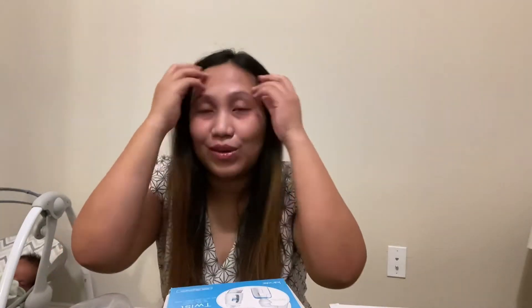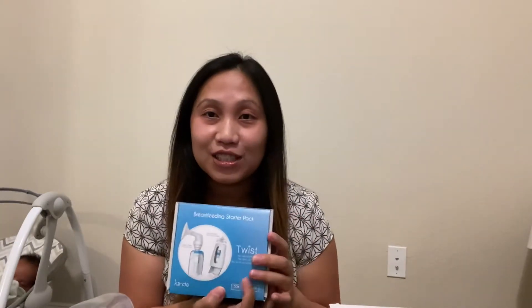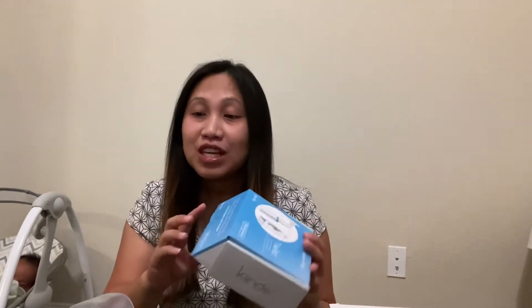Remember when I did the unboxing of my breast pump? Along with the breast pump, I ordered the Kiinde system for milk storage bags. So here's the starter pack that was included in that box as well. I'm going to open it and show you guys what's inside.